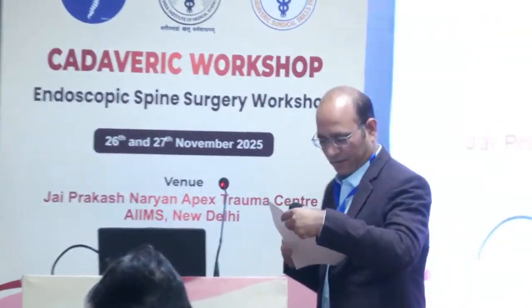if you are doing 5-6 cases a day, what people do, like we have seen abroad, they just put a flow seal, put a drain, close it off, put a pressure dressing. But in that case, you should not be leaving any spurter out, especially when there is oozing. Otherwise, keep some time, do meticulous hemostasis and come out. It should not be a big problem because more or less it is still open in front of you, right?